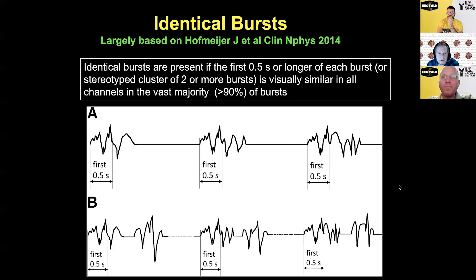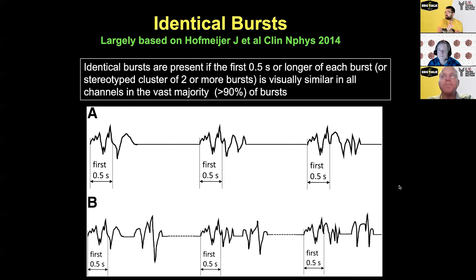If the first half-second of every burst looks similar across all channels in 90% of bursts, that's considered identical bursts. You can see here the first half-second is identical for all three bursts — it doesn't matter what happens after that, just the first half-second. Sometimes it's a couplet of bursts, and as long as the first half-second of the first one always looks the same, that's still identical bursts. Importantly, they don't have to be highly epileptiform — identical and highly epileptiform are two different things.